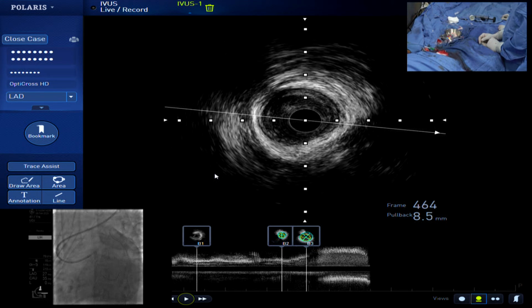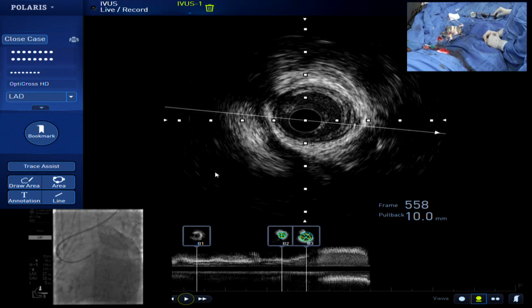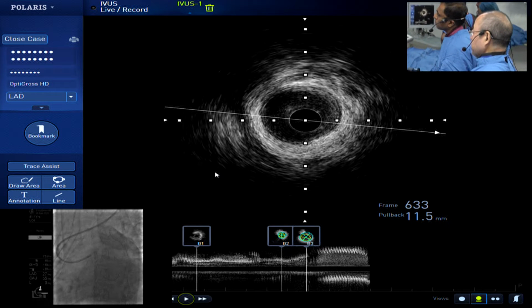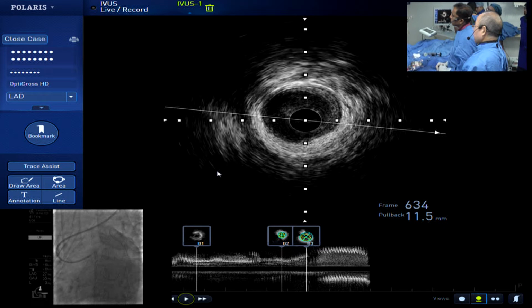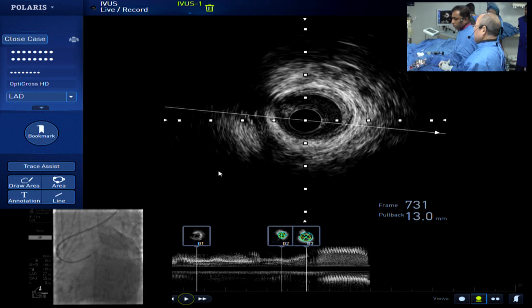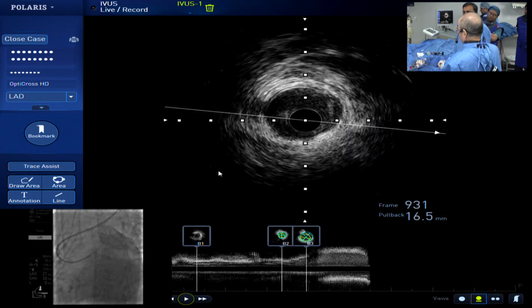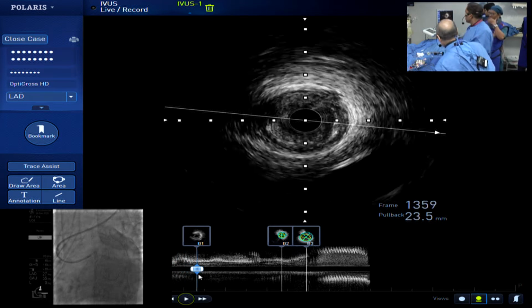Yeah. Also, by angio, the angle of LAD and the diagonal is very narrow, so there is some risk of pinching the diagonal branch if you cross over the stent. Yes. So you are thinking about kissing balloon if there is some pinch. Yes. Okay, thank you. So the problem is the size of the stent. Now I'm thinking that the diameter should be 3.0, and the length, I don't know the length.